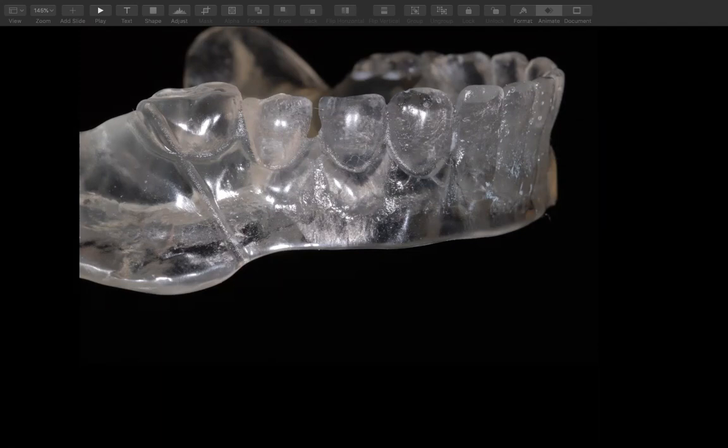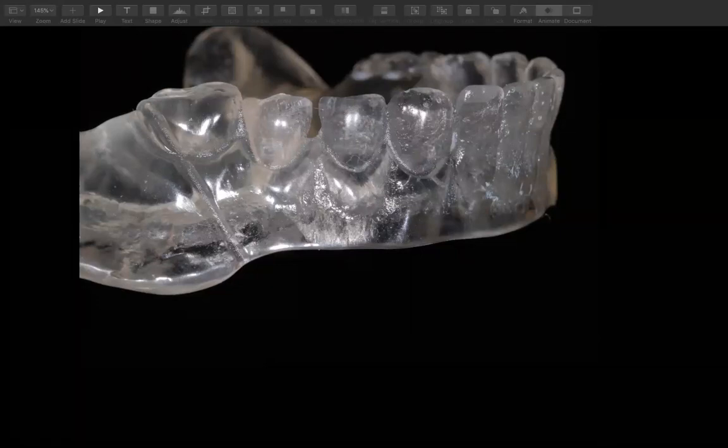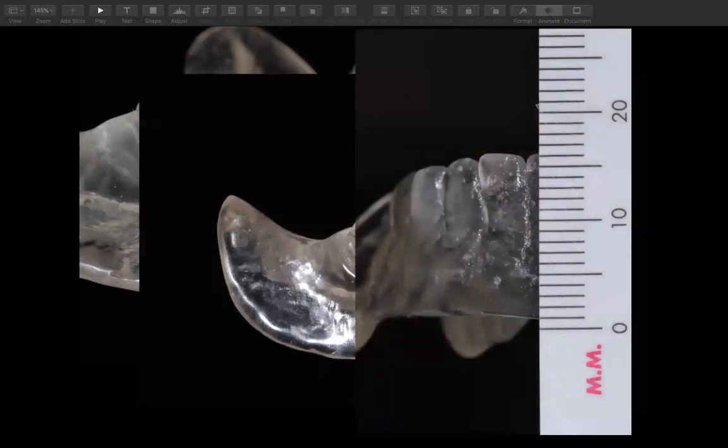I did put a slice, a 30-degree angle slice on the facial, if the doctor's freehanding that, for their posterior implants. These are typically put in at a 30-degree angle for the typical all-on-4 technique. Some doctors do it straight, some may not angle it, but this particular doctor wanted us to put the groove in there to help them eyeball that 30-degree angulation. So here it shows 16 millimeters, but I'm measuring from the 1. So this is our 15 millimeters in height that I talk about.